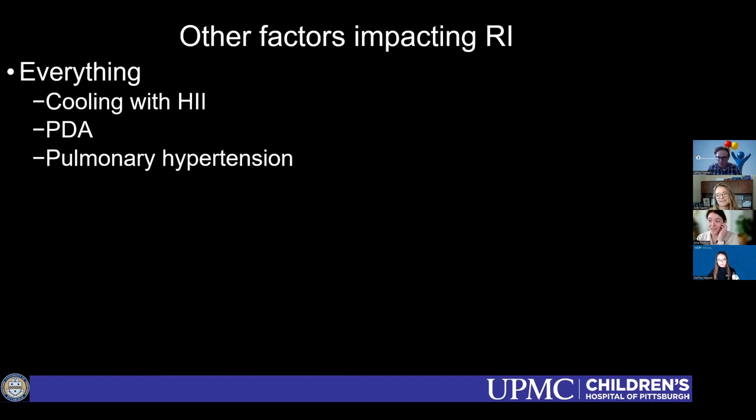That's a great point. I feel lucky that I'm in the camp where I can add it on to every single one of my head ultrasounds without having to do that. So we've just built it into our protocol. For us at CHOA, especially because we have our NICU in our own freestanding children's hospital, but we also cover NICUs at multiple adult mother-baby hospitals, and we're the ones reading the majority of their head ultrasounds.